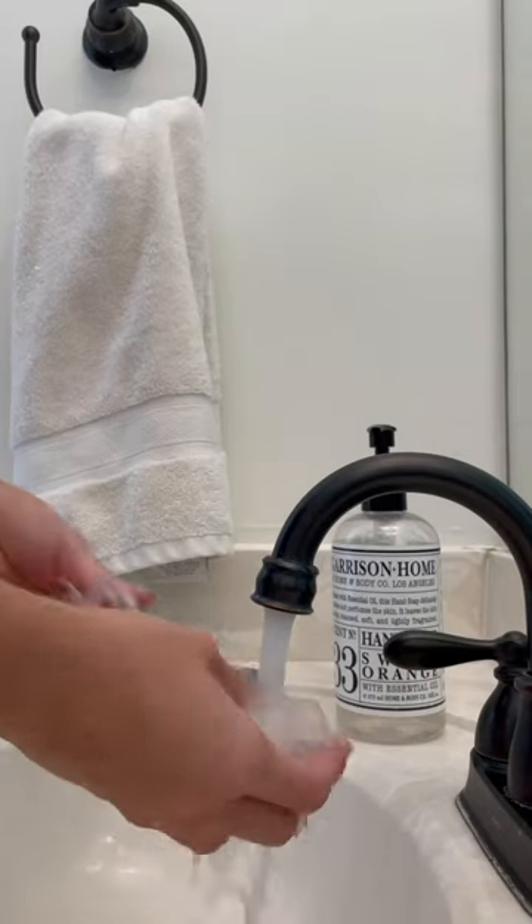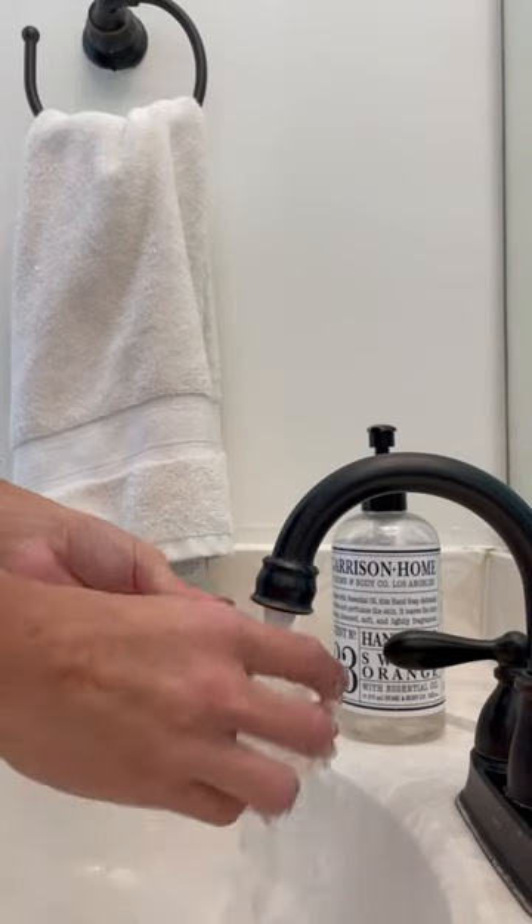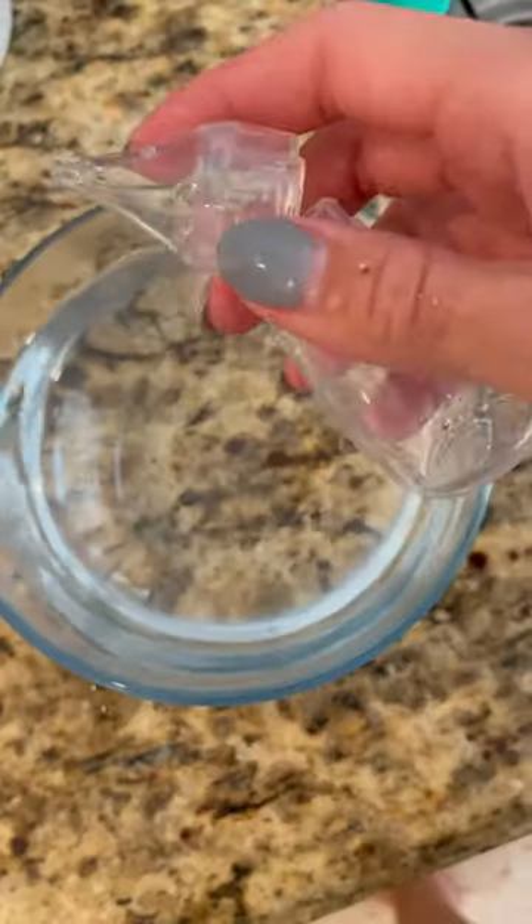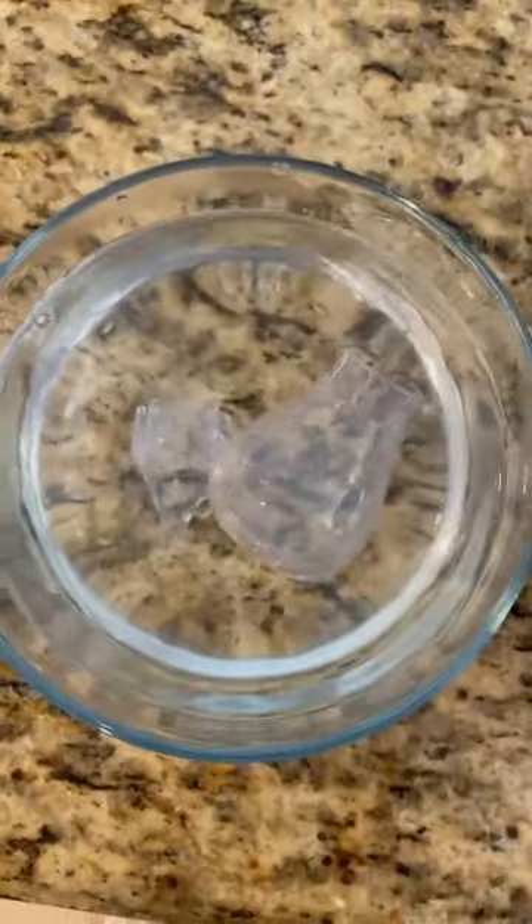As you can see, it got a good amount of congestion, and it is super easy to clean as well. You can use warm soap and water and then place it in boiling water for two to three minutes to sterilize it.